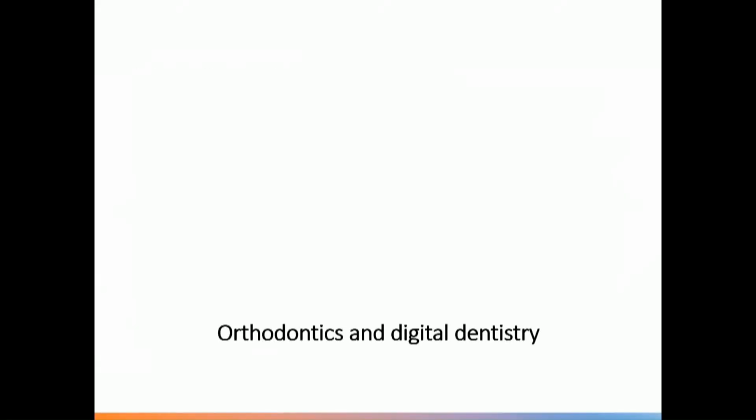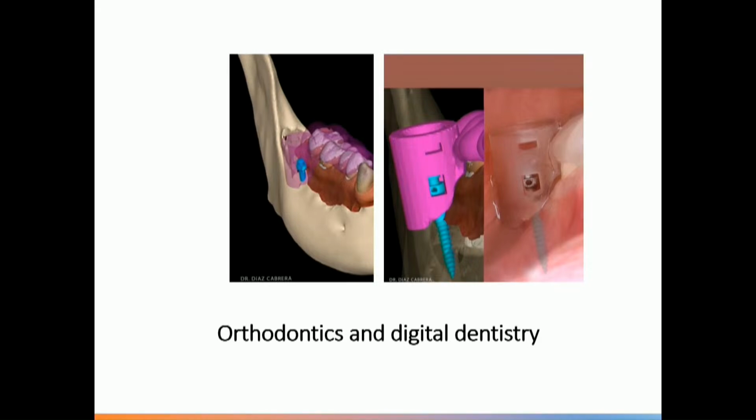Not only that, they can even use this technology in placement of mini screws. And this is a case by Dr. Diaz.